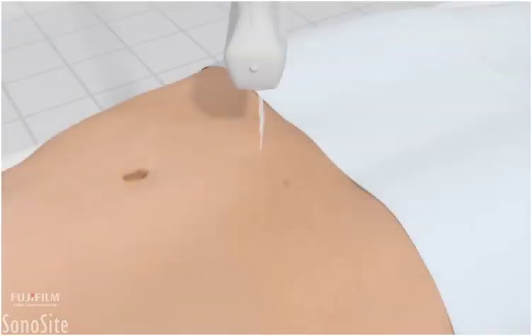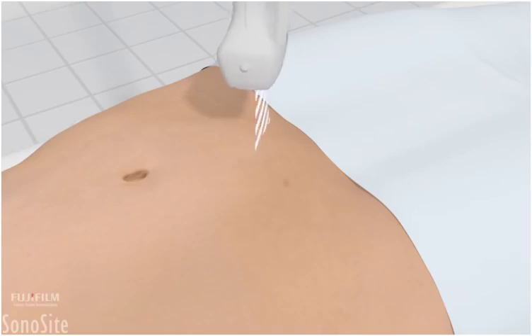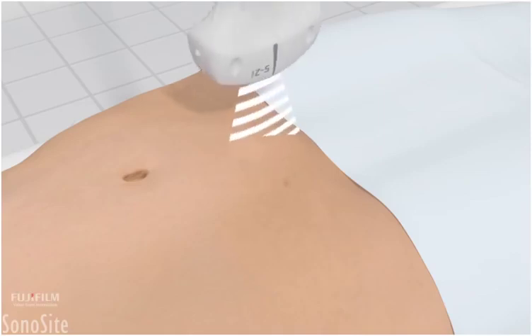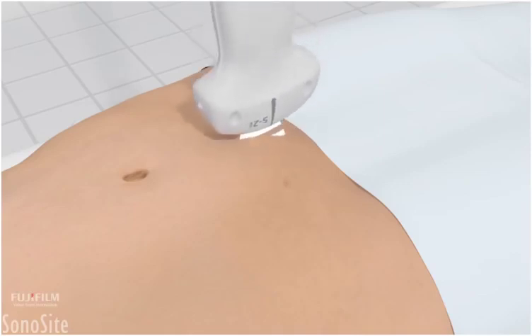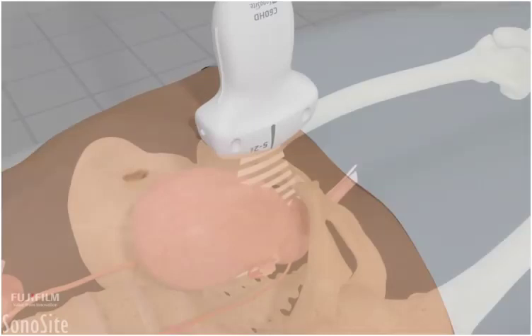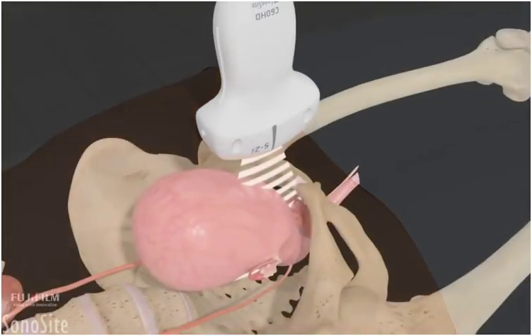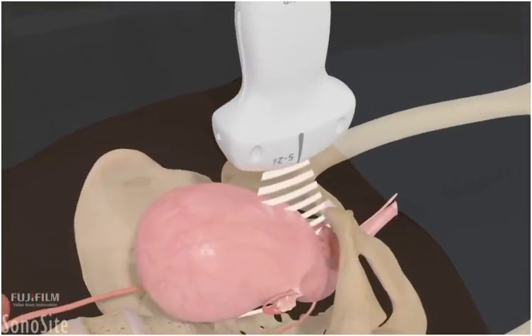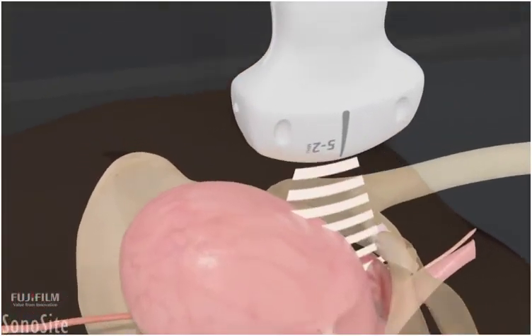It is helpful for the patient to have a full bladder to complete this examination. The transducer is placed in a longitudinal orientation in the midline at the level of the symphysis pubis, with the orientation marker directed toward the patient's head.